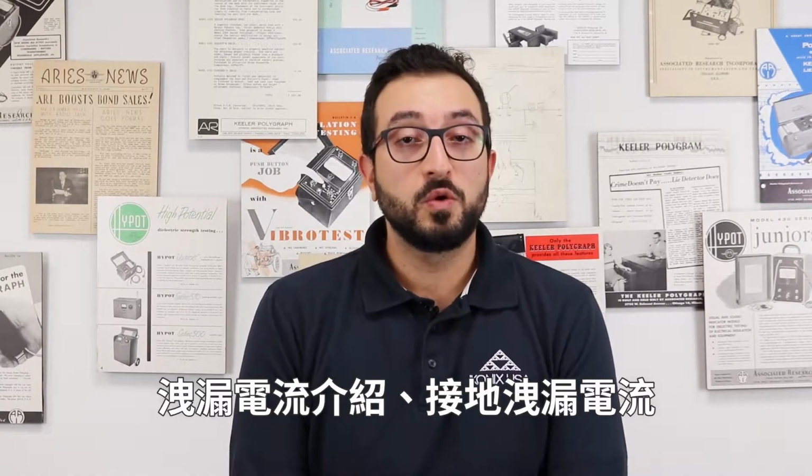My name is Syed Abidi, and in this two-part video I'm going to talk about another type of leakage current test called the patient leakage test. Before we go any further, I would like to remind everyone that in the past we have created videos on introduction to leakage current, earth leakage, and touch current, and we highly recommend that you view those videos.